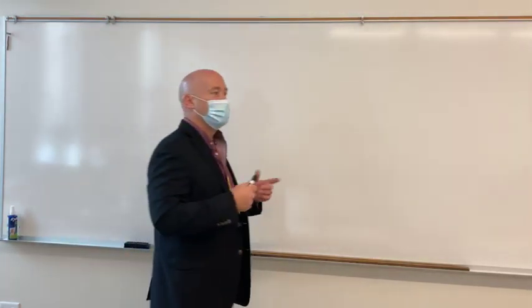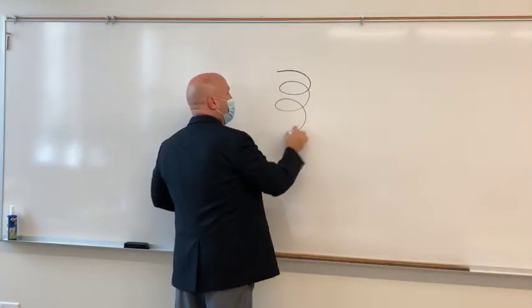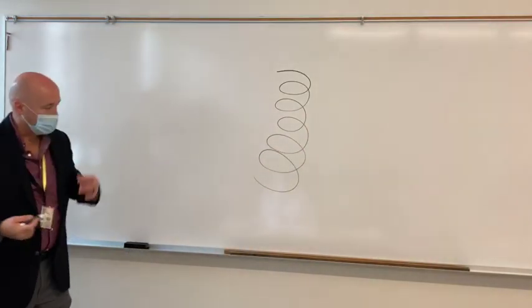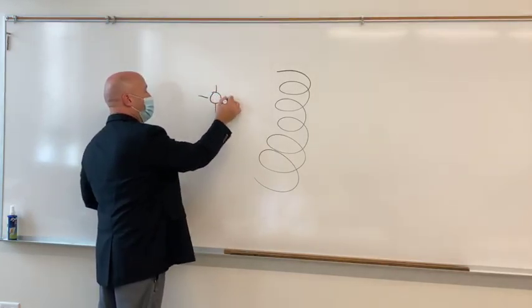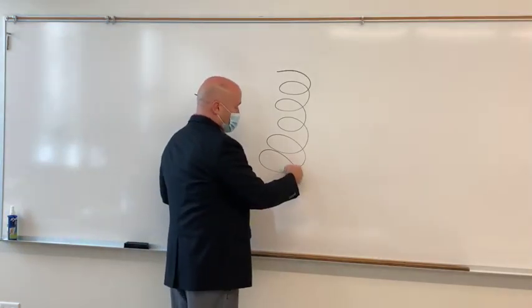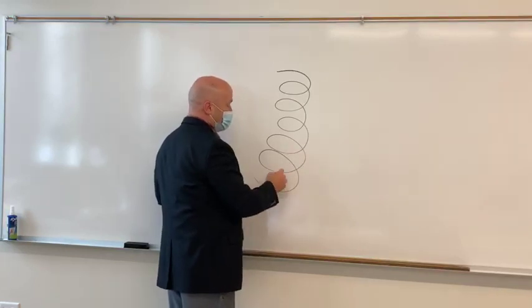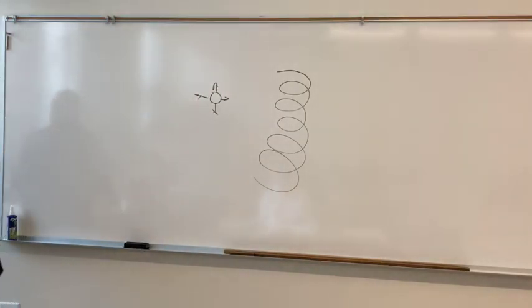So if we take our wire and we coil it up, then essentially what we can do is take the magnetic field around each one of those wires, because again, our magnetic field orients perpendicular to the wire, so it's reaching out in all directions. If we coil it up, we can take the individual magnetic fields around each of those wires and join them together to create a bigger, stronger magnet. And we'll talk more about that here in a bit. So we talked about similarities there.